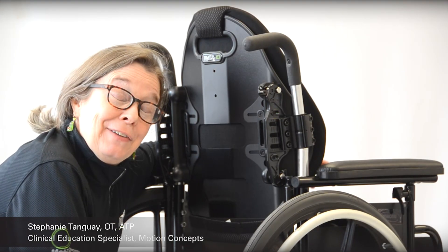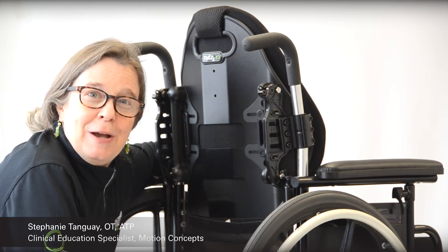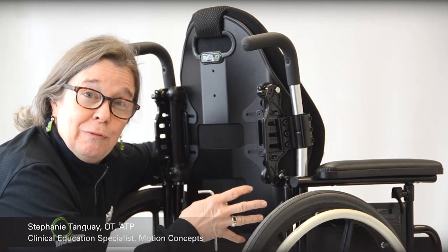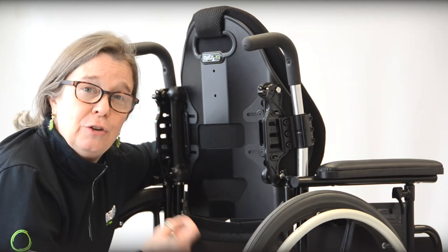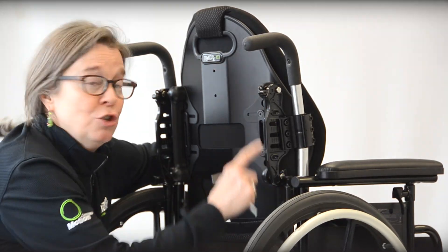Hi, I'm Stephanie Tangway from Motion Concepts, clinical education specialist for Matrix. We're going to do a little review of the Matrix Elite E2 back in the two tallest sizes — the 18 tall and 20 tall — that use the EasySet hardware, our larger hardware.